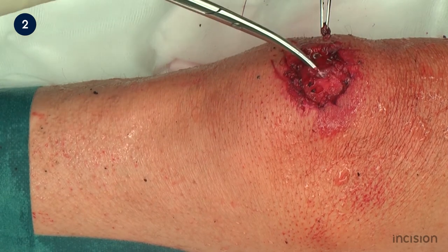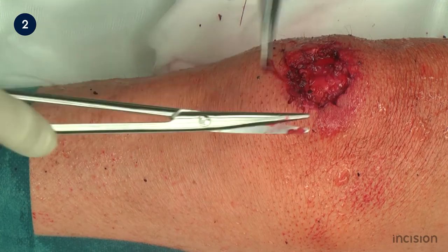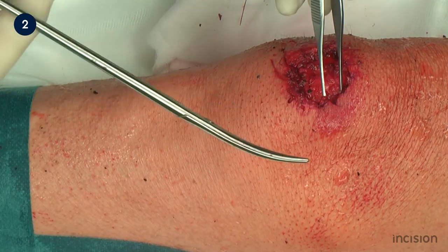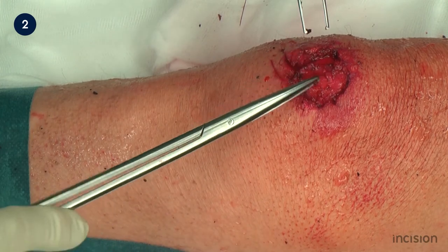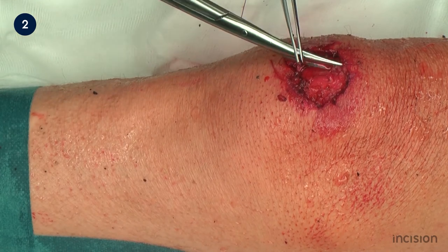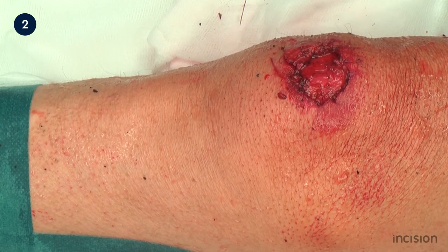All non-vital tissue is excised from the wound bed. Depending on the nature and the type of the wound, this may involve the removal of tissue from cutaneous, subcutaneous, fascial, muscular and or bony levels. Excessive tissue resection should be avoided by paying close attention to the demarcation between vital and non-vital tissue. If the vitality of the tissue is unclear, a staged debridement, or adjunct use of non-surgical methods of wound debridement, can be considered to minimise the damage to healthy tissue.